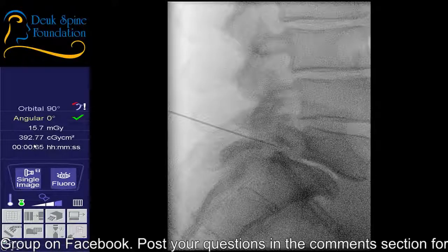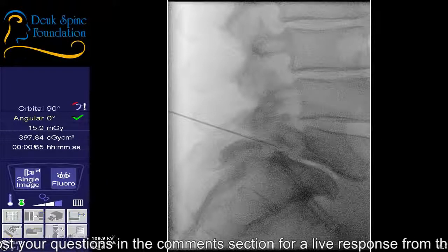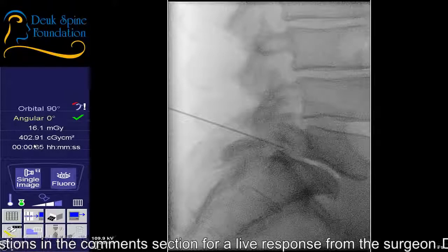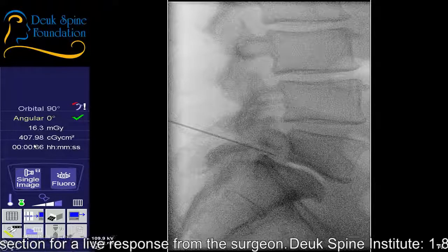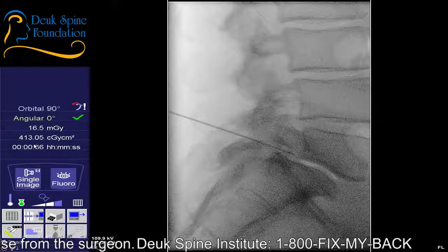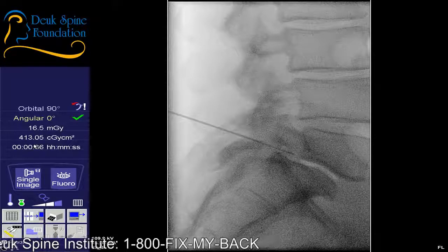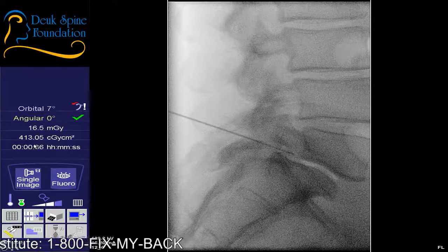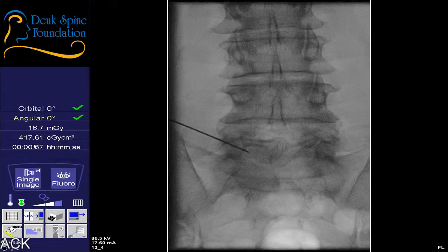Shot. Any discomfort? Shot. AP. Yeah. Again, we're right there, right at the disc, which is good.